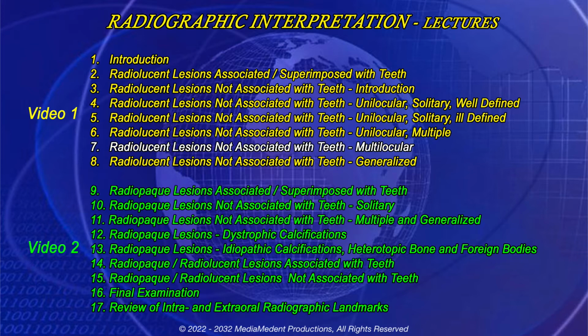This free video, Those Lesions Not Associated with Teeth that Present as Multilocular Radiolucencies, is Lecture 7 of the series. You may view this free lecture for your own assessment as to quality and content.